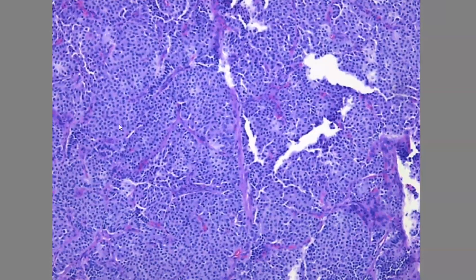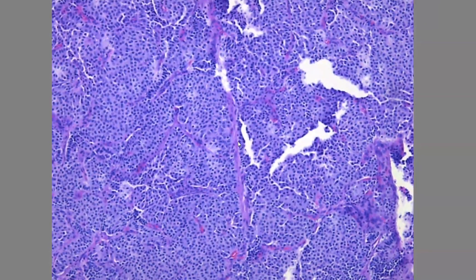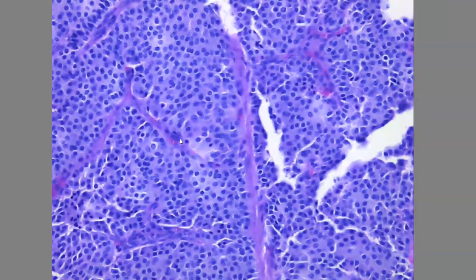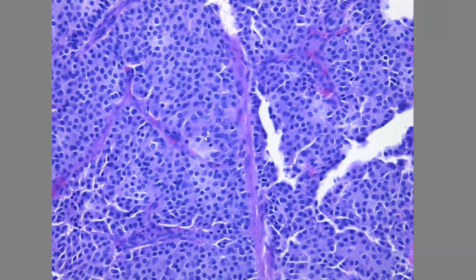At this architecture level, you can feel that the cells are well-spaced from each other, with a kind of uniformity. Let's go to higher power to appreciate the nuclear and cytologic features. At this power, you can appreciate that the cells have a partially eosinophilic cytoplasm and a rounded to oval nucleus.